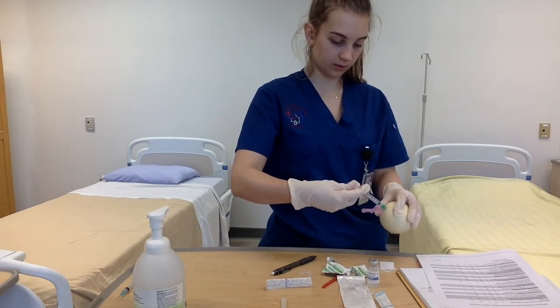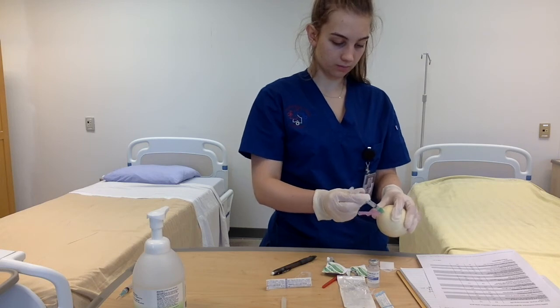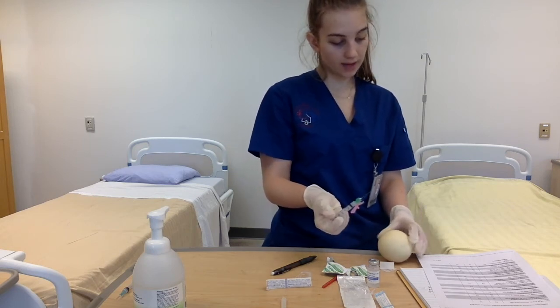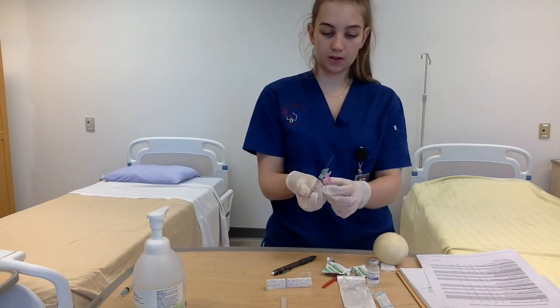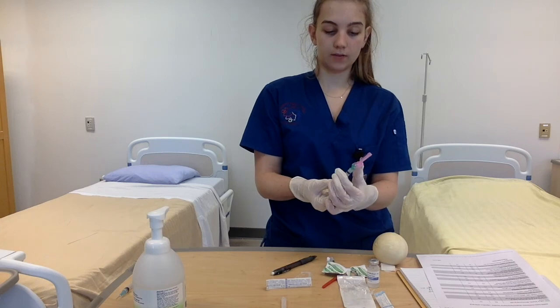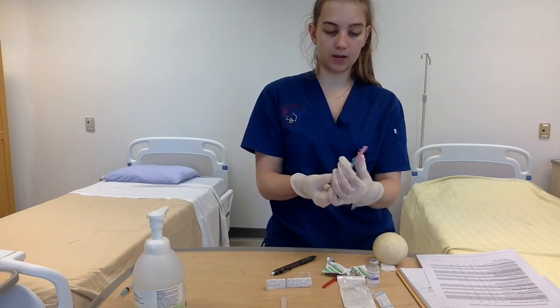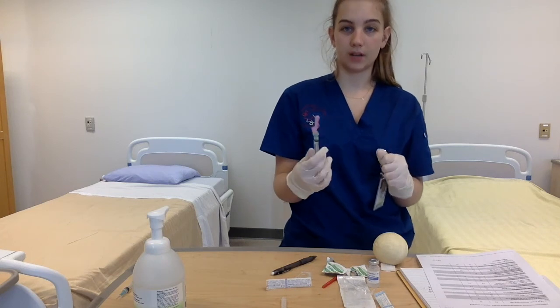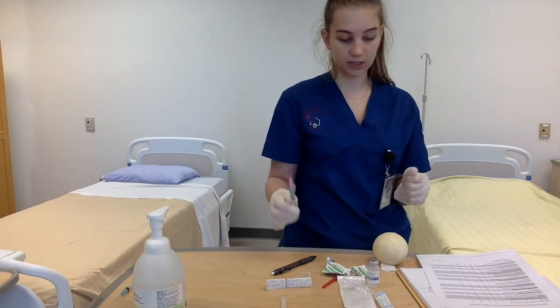And slowly inject the medication and bring the needle back out. And then to safely dispose of this particular needle, it actually has a safety device, so you just clip this in like so, and then I can safely dispose of the needle along with the other one in the sharps container.